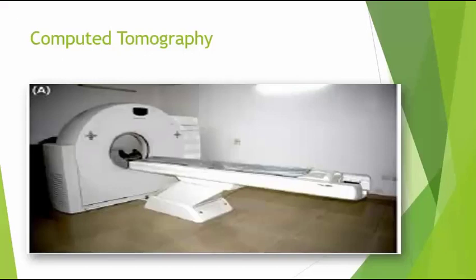Computed tomography uses ionizing radiation to give us imaging of a variety of structures in the body. It is now considered the gold standard in oral and maxillofacial surgery, especially in cases of trauma, as we will find out in the next slides.